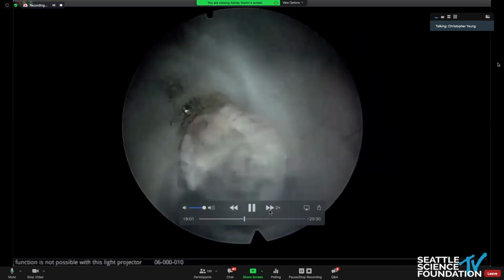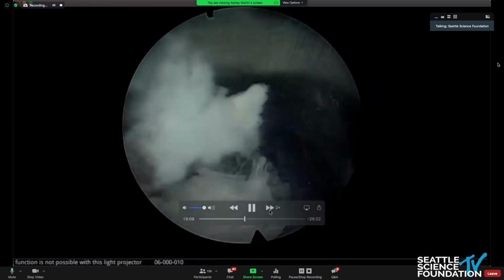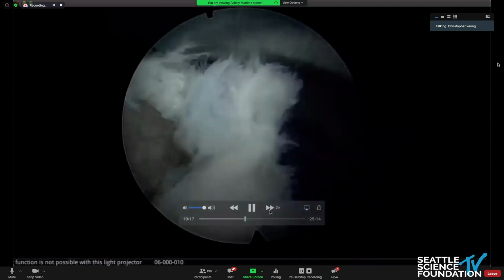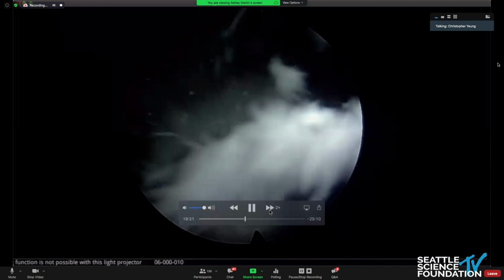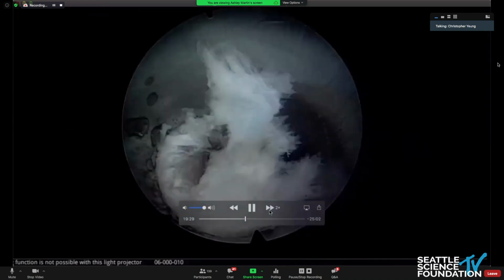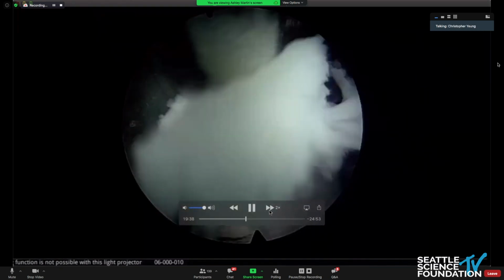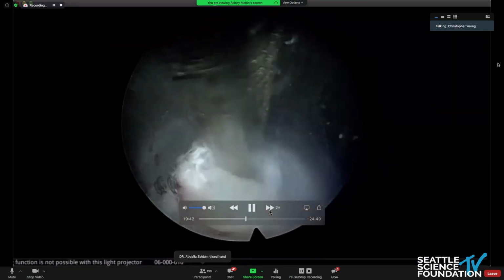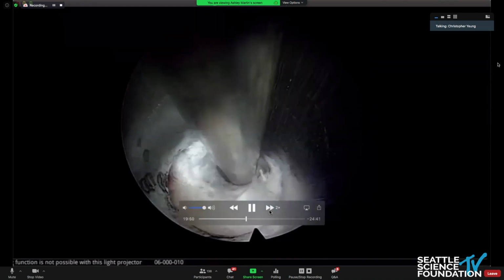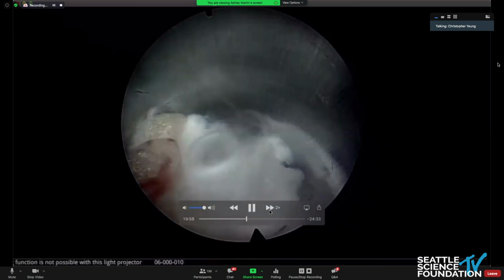Okay, and then after you do that, how do you know when enough is enough, Chris? How do you know when you've done enough of a discectomy? Yeah, so it's kind of routine for me. I'll go in and visualize with the endoscopic forceps and get as much as I can. A lot of times we get everything at that point. And when I've gotten as much as I could from that view, I will use the larger non-endoscopic pituitaries.